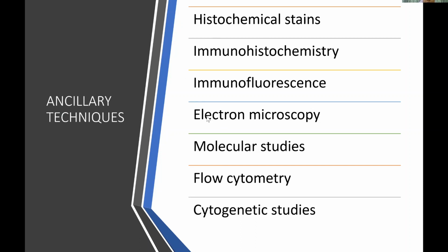EM we have in the COM, but not for diagnostic use; it's very rare for diagnostic usage. For molecular study, we have HPV testing by using PCR. Flow cytometry is still not available yet. Cytogenetic, we are developing a cytogenetic study in our lab.